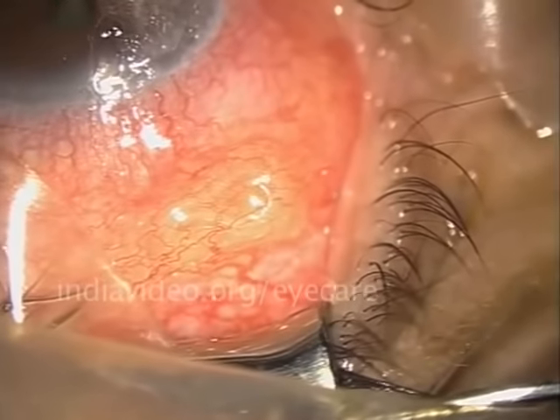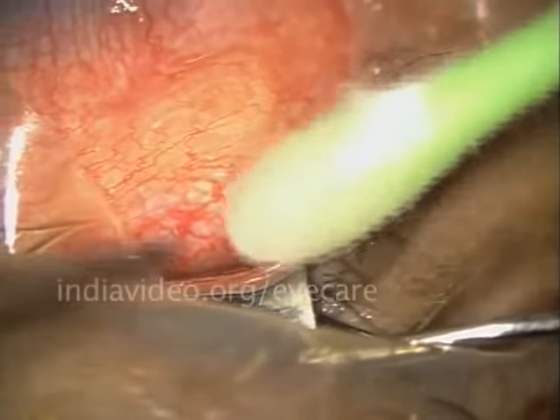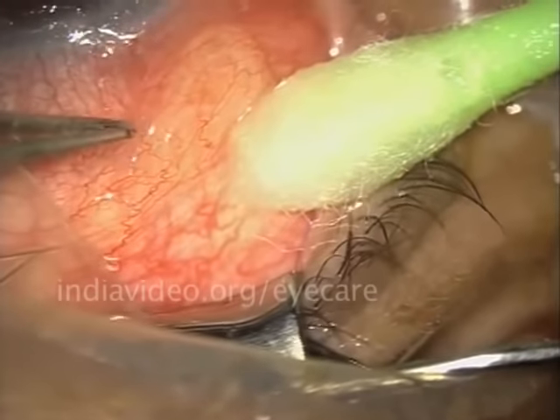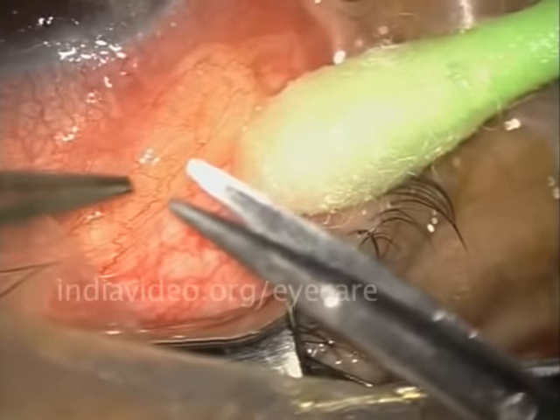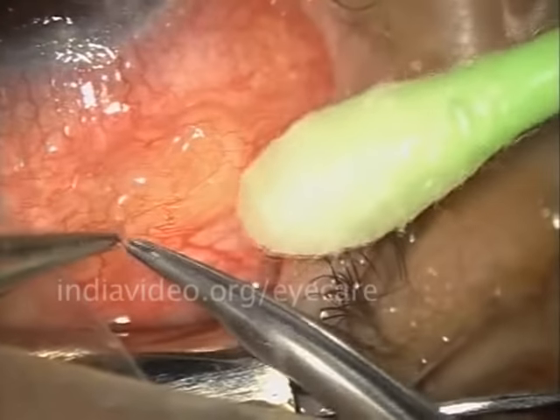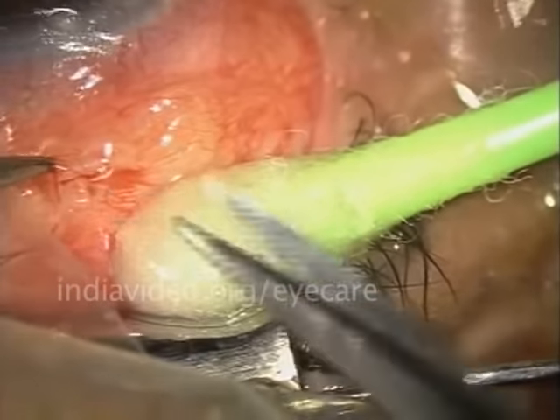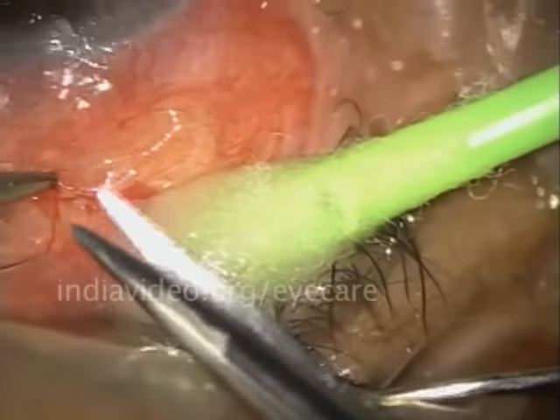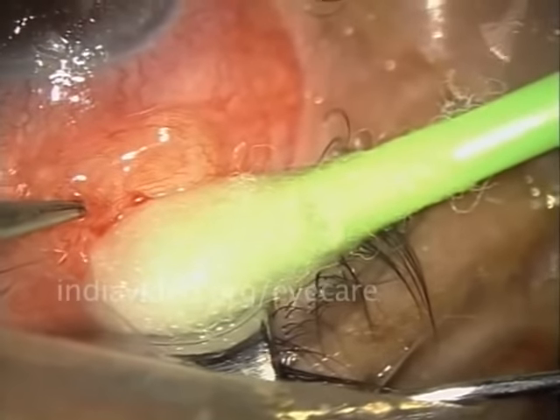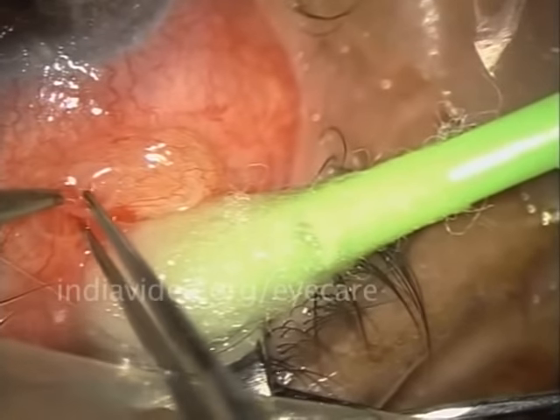We have to make sure that this is indeed a worm. If it is a worm, it will on likelihood escape to other parts of the body the moment we touch it or interfere with it. So to prevent that, the nurse has barred its posterior movement with a cotton bud. The cotton bud has to be placed at least near the centre of the worm's body to prevent it from sliding back into the eye and behind into the brain.